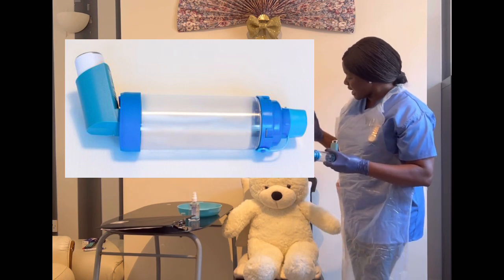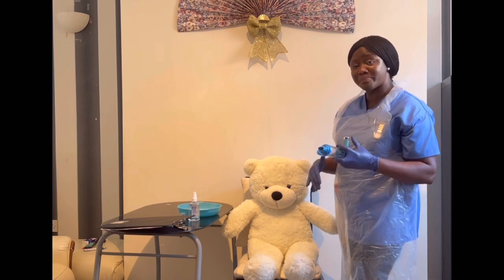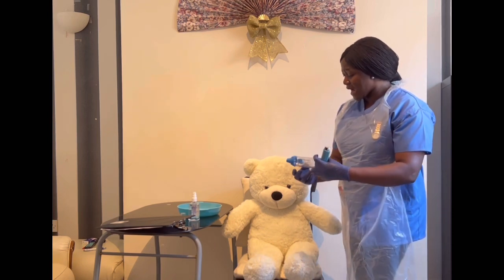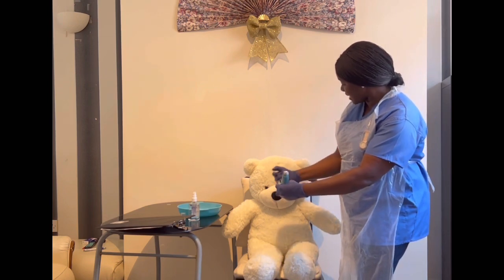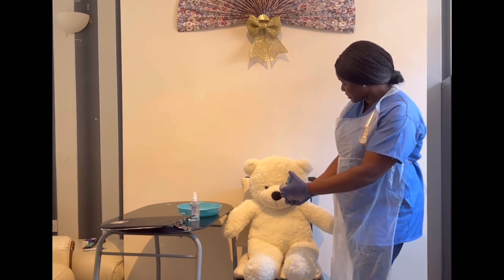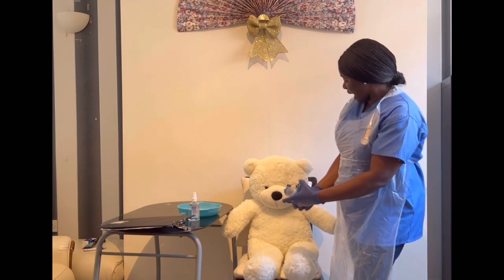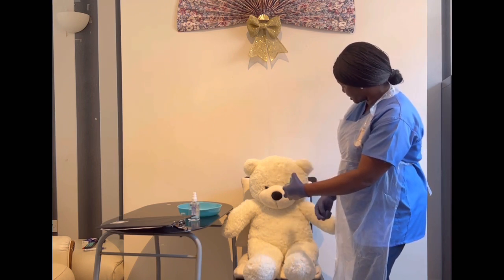So Harry, I will need you to exhale completely as if your lungs are completely empty. Is that okay? Okay, nurse. Then you form a tight seal with your lips on the spacer device mouthpiece, and you start to breathe in slowly for 2 to 3 seconds while I depress the canister, and make sure you are not biting the mouthpiece, but forming a tight seal with your lips.